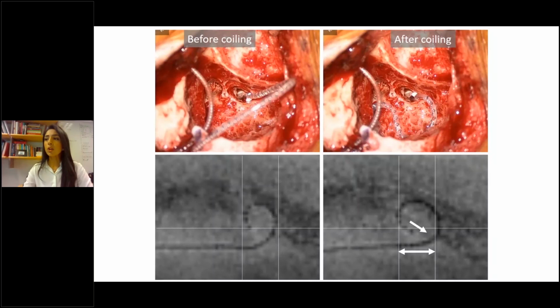There is also a risk of intracochlear movement of the electrode array during coiling of the lead in the mastoid, especially when soft sealing has been done. Here we can see electrode array position before and after coiling. On the left side, there's a fluoroscopy picture showing that the electrode seems to lie more proximal to the modiolus. Whereas after coiling, and probably a bit deeper insertion, the electrode has moved more laterally in the basal turn. So it is desired to keep the electrode very steady during coiling, as it may cause malpositioning of the electrode inside the cochlea, which is not very obvious to the surgeon if you don't have intraoperative fluoroscopy.